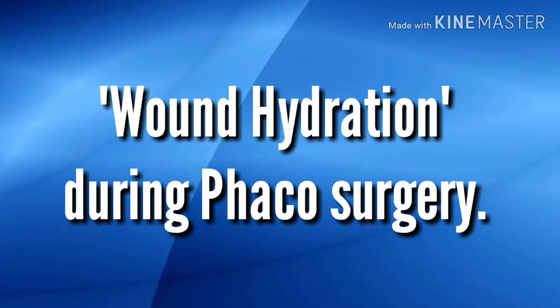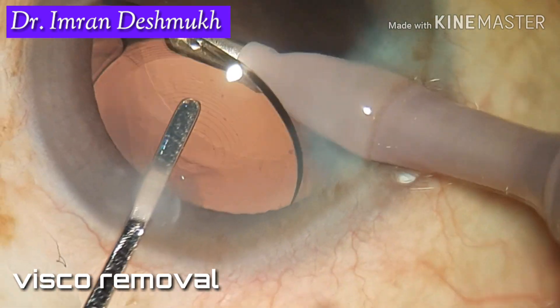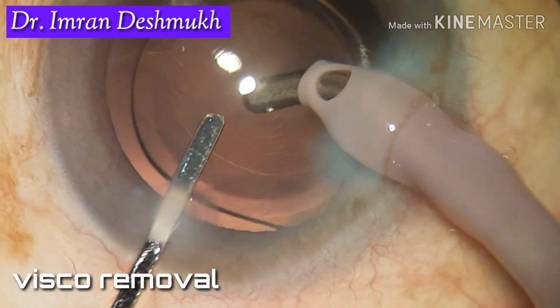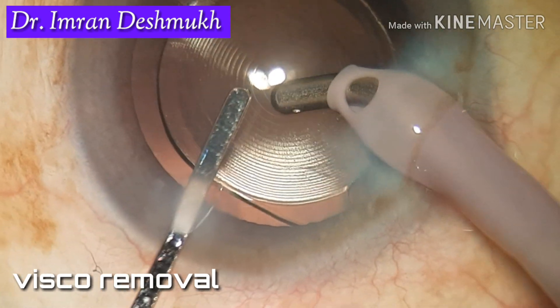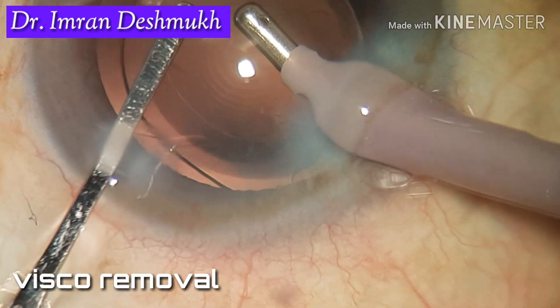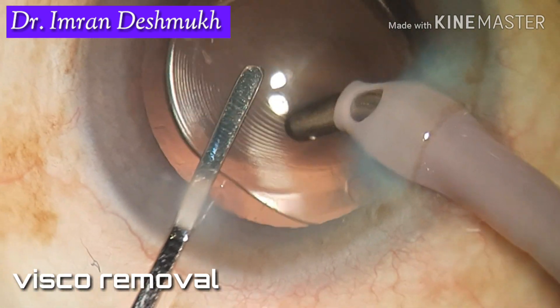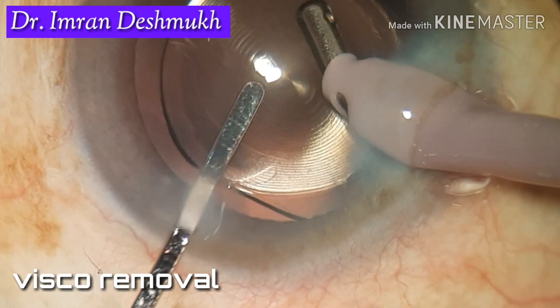Hello everyone. Today we'll be discussing how to hydrate the wound at the end of phacoemulsification cataract surgery. Last time we showed how to remove the viscoelastic after IOL implantation. The important part is to remove as much visco as possible — don't leave any visco behind, as that can lead to a rise in IOP in the post-operative period.